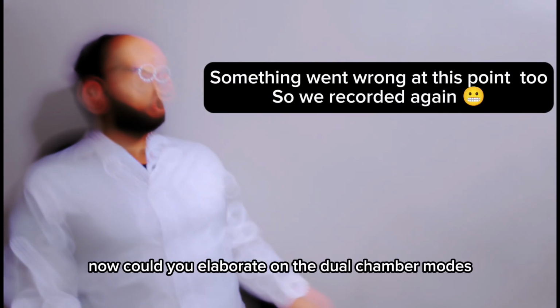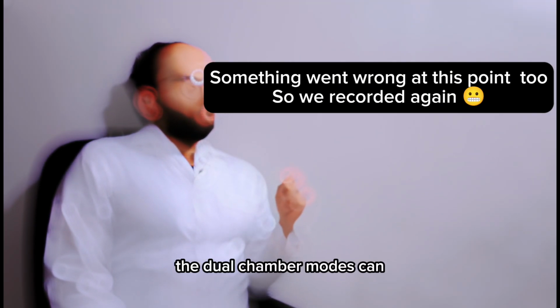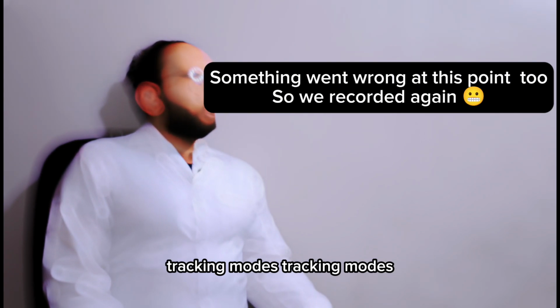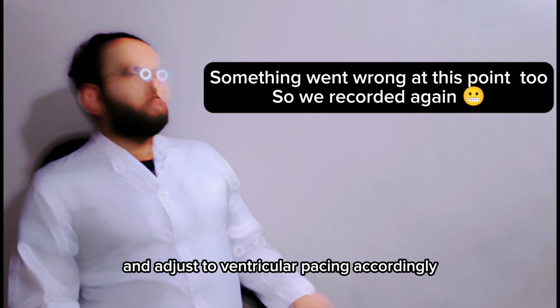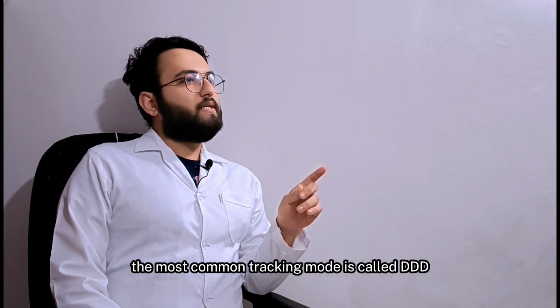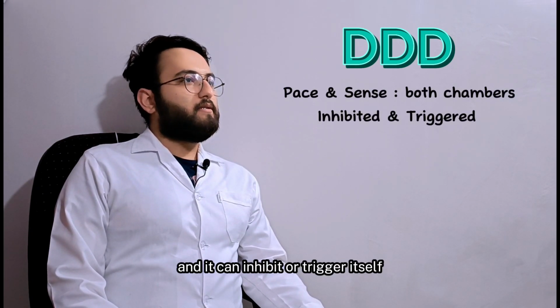Got it. Now, could you elaborate on the dual chamber modes in pacemakers? Certainly. The dual chamber modes can be further divided into tracking modes and non-tracking modes. Tracking modes are designed to follow the intrinsic activity of the atrium and adjust ventricular pacing accordingly, such as DDD or VDD. The most common tracking mode is called DDD. This means that it paces and senses both chambers of the heart, and it can inhibit or trigger itself depending on the signals.